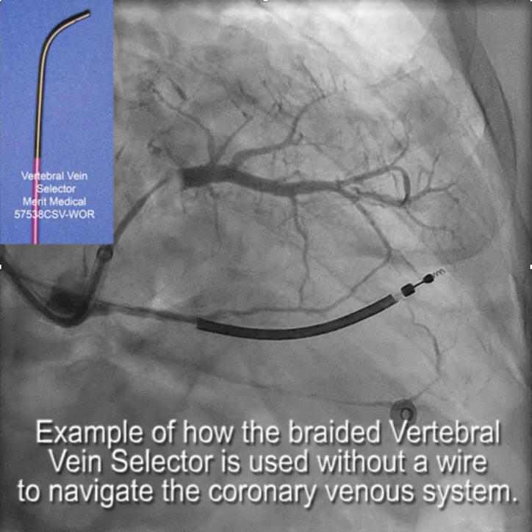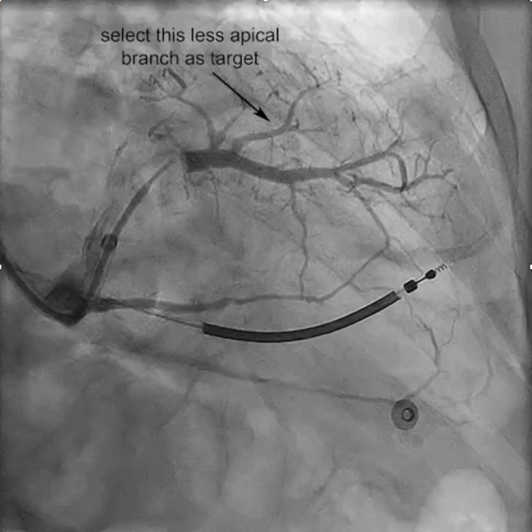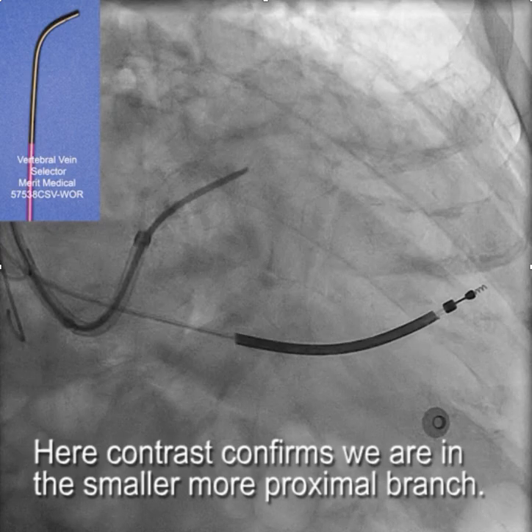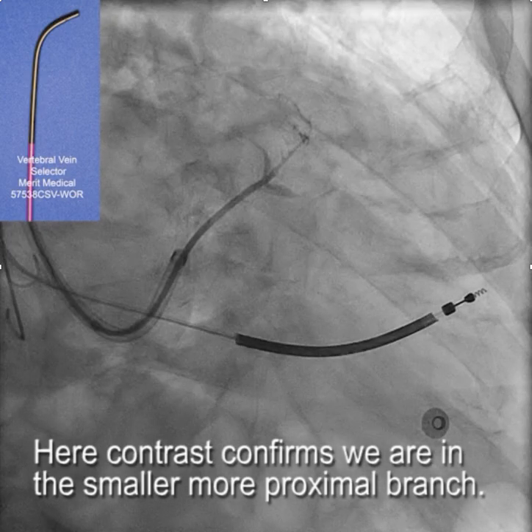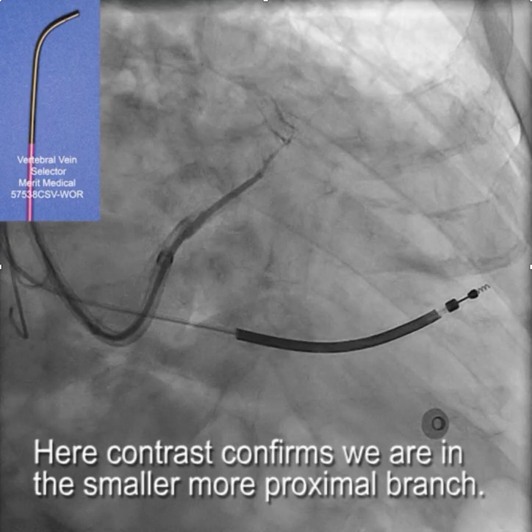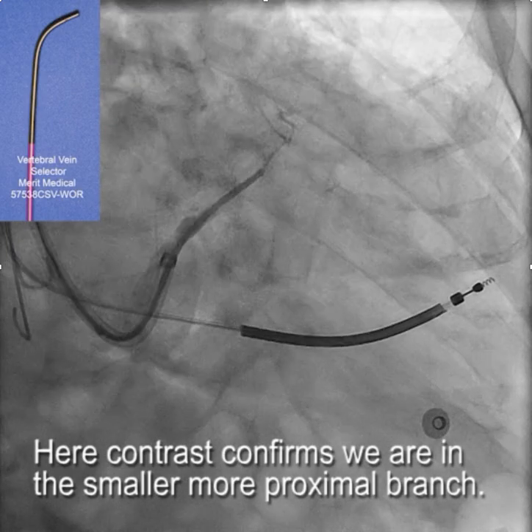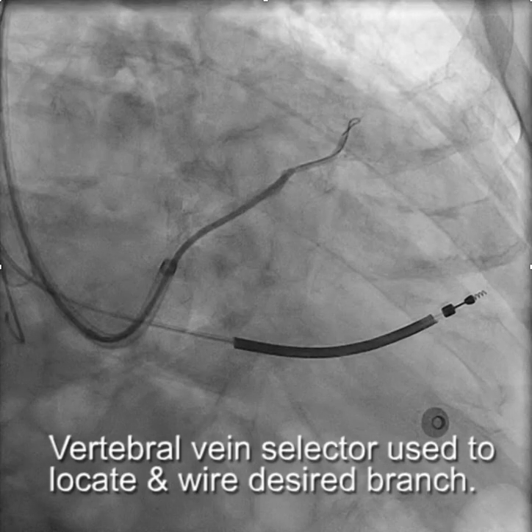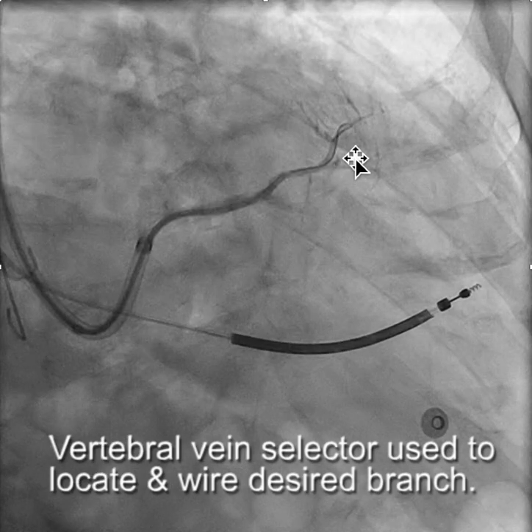This is the initial venogram. We selected this branch as mentioned, then put the vein selector in and drove it around looking for that branch. We got into a branch, injected contrast, and you can see this is not the branch we really wanted — it's one of the smaller, more proximal ones. So we drew it back, pushed it in again, puffed a little contrast, and found the larger branch.